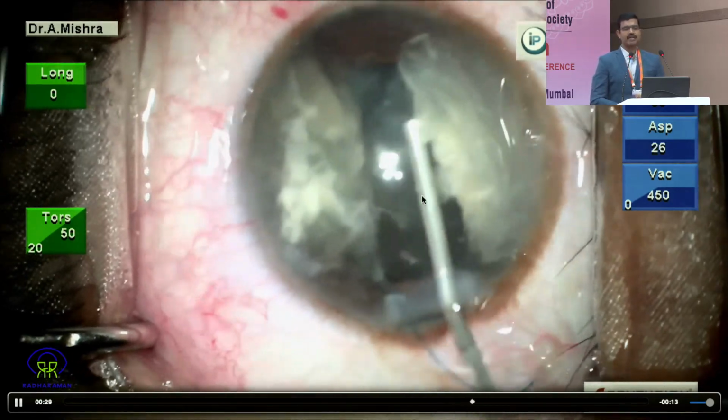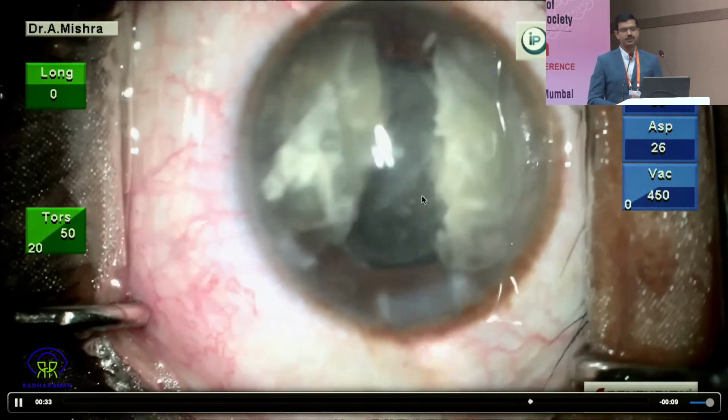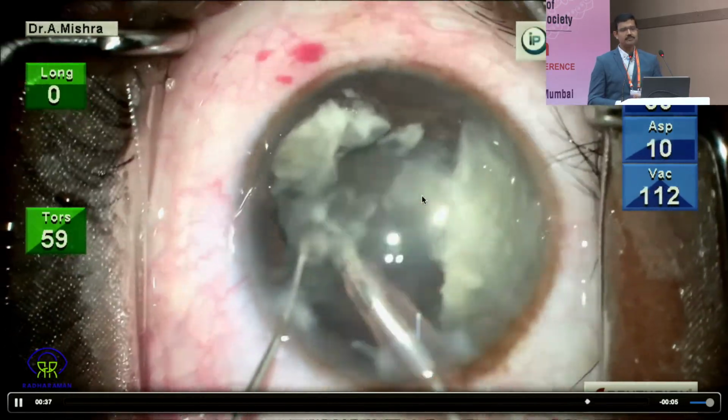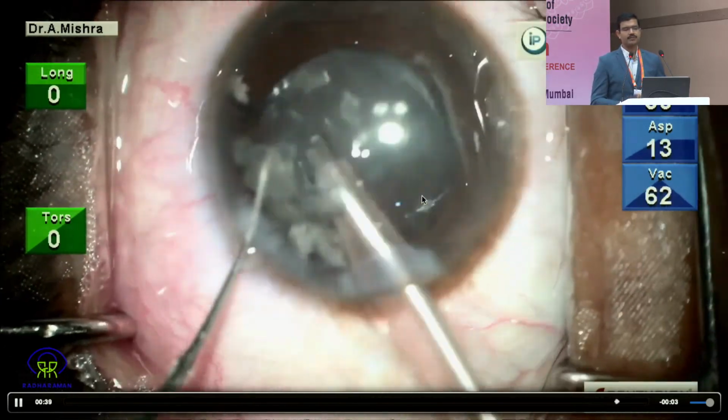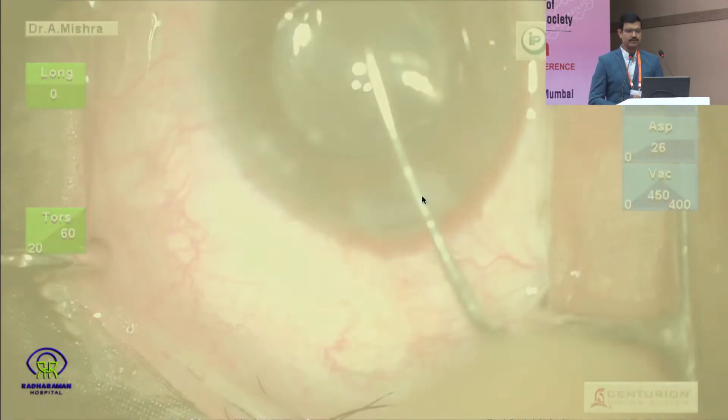Take the advancing haptic into the sulcus, keep the optic in the pupillary zone, and the trailing haptic remains somewhere in the iris. Protect the endothelium, go ahead and chop and finish off the business with the nucleus, and then the epinuclear plate, and then roll the trailing haptic into the sulcus to finish off the procedure.